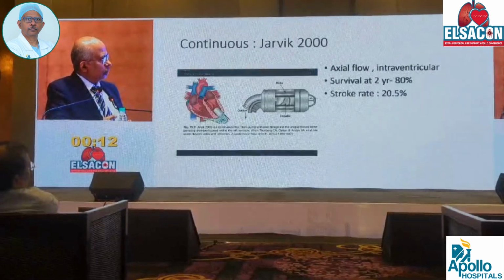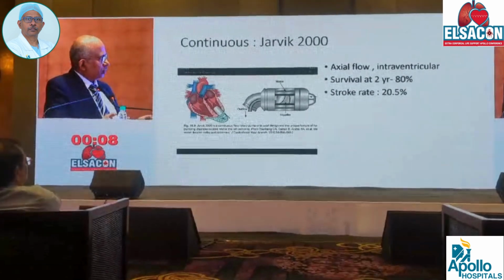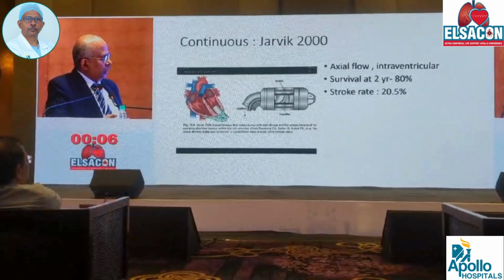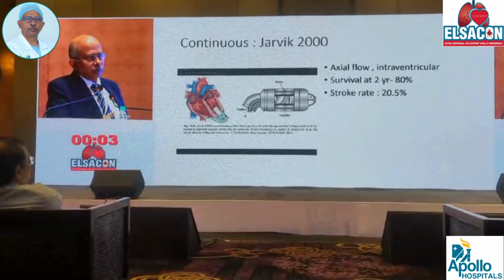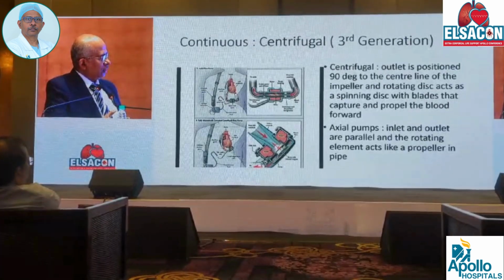So this slowly got developed into another axial flow pump which we had used in our patients. This is called the Jarvik 2000. And the main problem with these pumps is that the stroke rate is very high. And slowly you can see the difference of the thing.